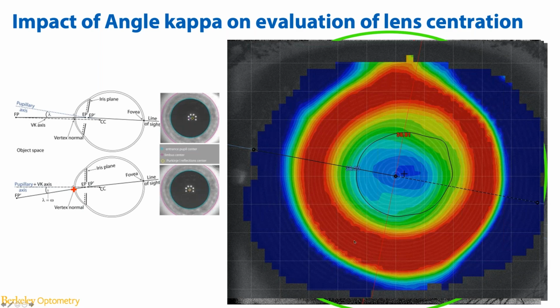Currently, we don't know whether a narrower but more dramatic paracentral steepening works better than a wider but less dramatic paracentral steepening. And the third component is related to the size of the treatment zone, which is the location of the paracentral steepening. So the eccentricity, the width, and the magnitude, all three are, at least in animal studies, playing a role in terms of the overall anti-myopia efficacy. Currently, we don't actually know what's the best combination.